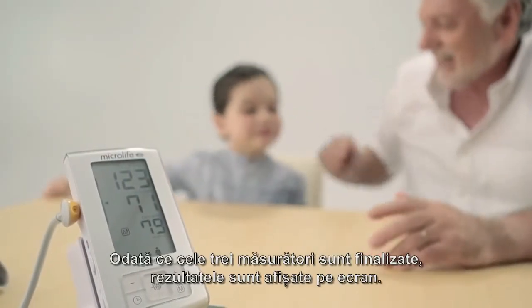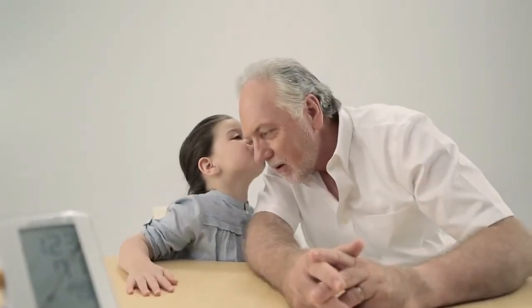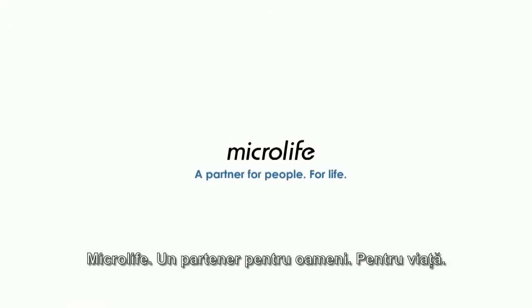Once 3 measurements are complete, the measurement data are shown on the display. Microlife — a partner for people, for life.